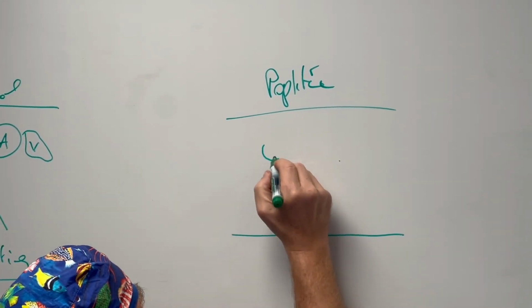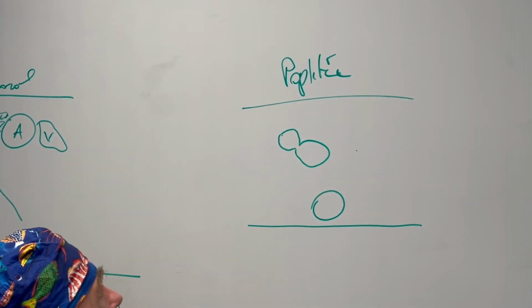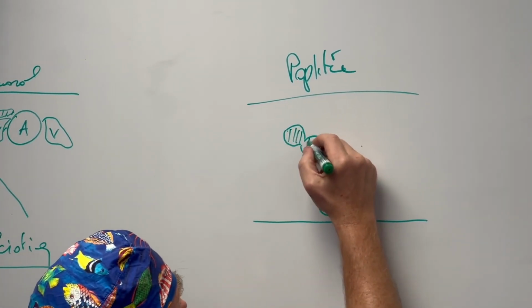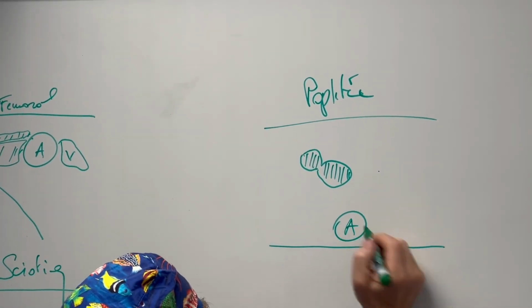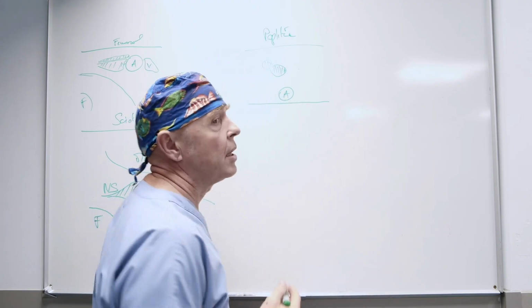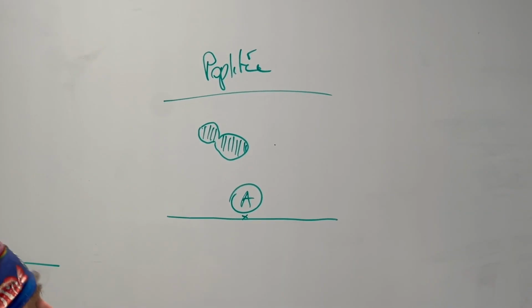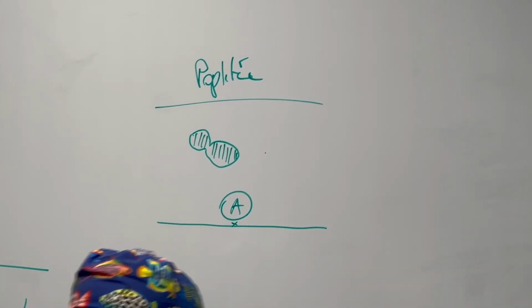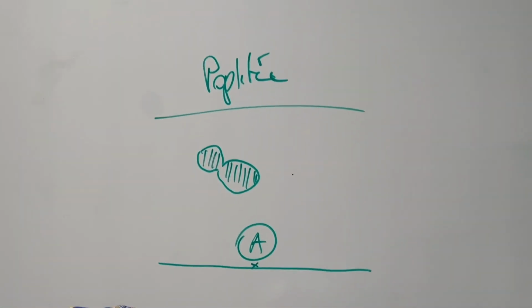At this level, the nerve will bifurcate, and occasionally you can observe it with the fibular and tibial components. The popliteal artery is essential, and we can utilize this diagram to indicate that if an IPAC is necessary, the injection will be administered precisely here. Consequently, these are the fundamental sonoanatomy components necessary for an approach to the sciatic nerve block at the popliteal level.